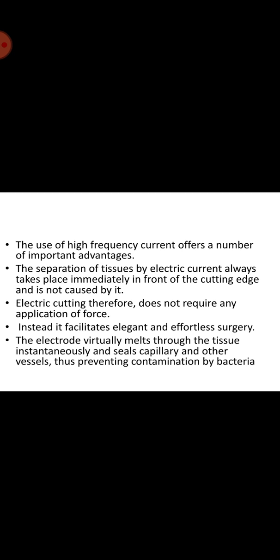As the detailed waveform and the frequency spectrum vary from one manufacturer to another, the basic concept requires a high temperature arc, possibly exceeding 1000 degrees Celsius. In practice, the cross-section of the arc is extremely small, considerably less than 1 mm diameter, leading to a high current density in the arc. As the heating effect is proportional to the square of the current density, the effect is localized to the arc. Other factors affecting the rise in temperature are the composition of the tissues and the magnitude of cooling provided by the local blood flow or any other heat transport system.